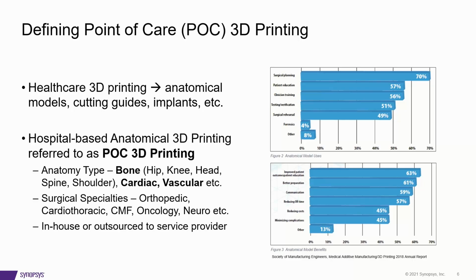Typically these are in-house or they can be outsourced to service providers to perform the actual printing. Sometimes a hospital or a medical device company doesn't want to do this in-house or invest in the hardware and software to do this, so they outsource this to a service provider.